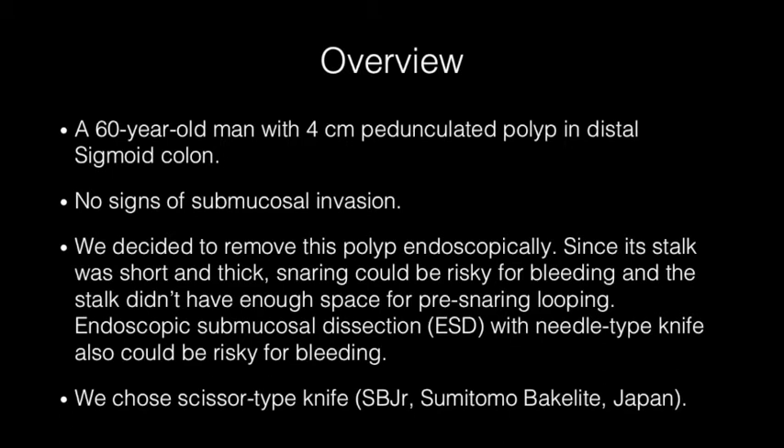A 60-year-old man with a pedunculated polyp, 4 cm in the sigmoid colon. Colonoscopic examination showed no clear sign of submucosal invasion. We decided to remove this polyp with an endoscope.